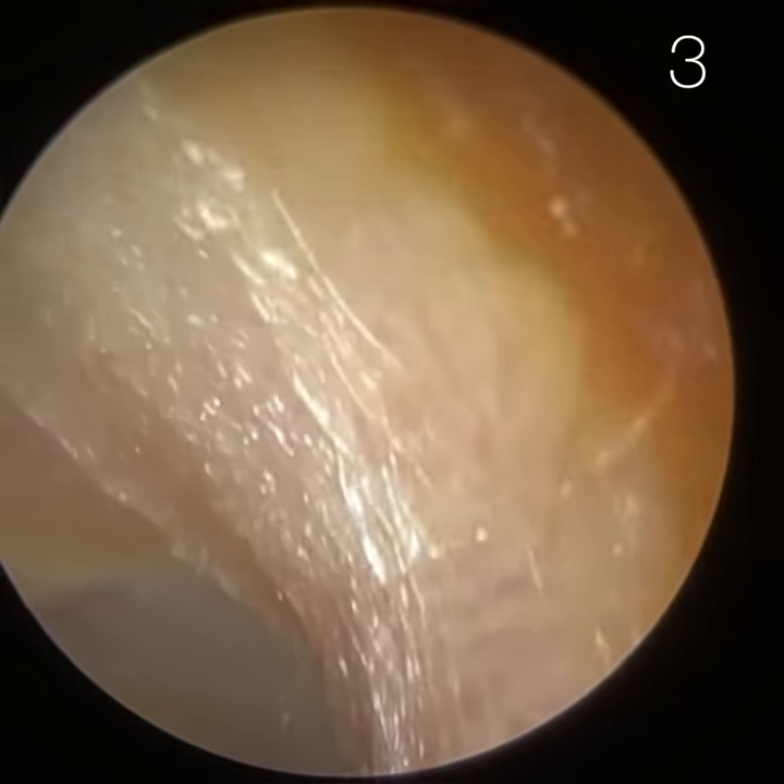I know this patient — I can remember them because they're a regular. This patient does trim their ear hairs and is now placing cotton wool at the entrance to prevent hairs flying in while trimming, because they can mat against the wax. The ear looks quite healthy — nice pink colour. The inner two-thirds appear very hydrated and the eardrum looks nice and healthy. But see how collapsed that entrance is — it's hard to get the instrument in. There will probably be a bit of debris left behind, but that's fine.